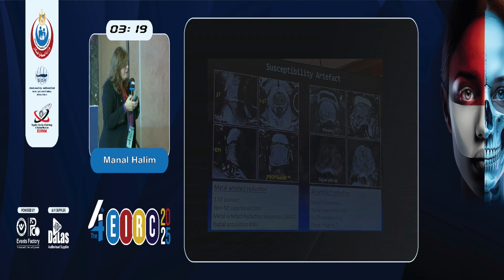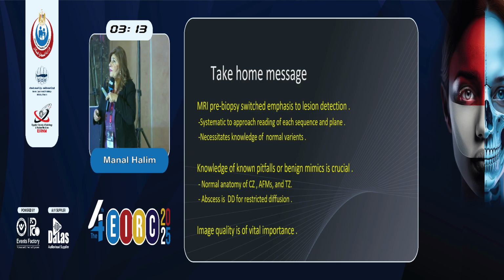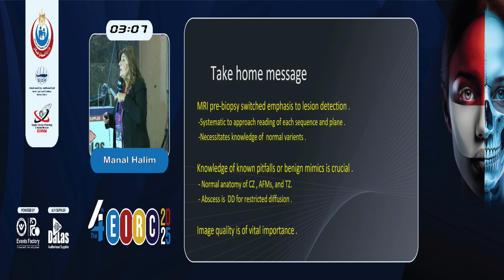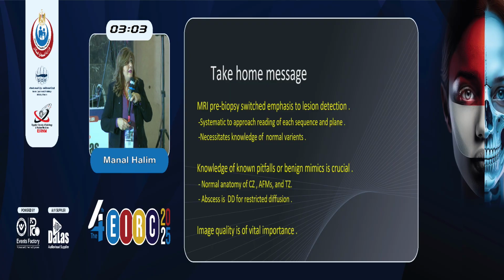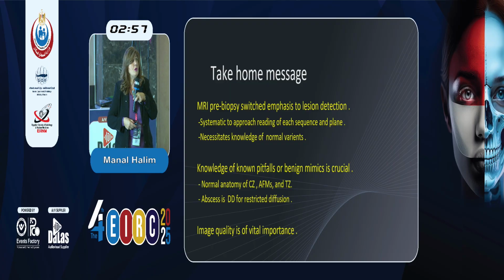And at last, I would like to conclude what I said: MRI of the prostate is not easy. It's complex because of the anatomy, because of the variability, and a lot of things. So we have a lot of pitfalls in the MRI. However, the most important issue is, please do MRI before you take the biopsy, because it helps you a lot in detection of the lesion and reveals the dominant part of the cancer.